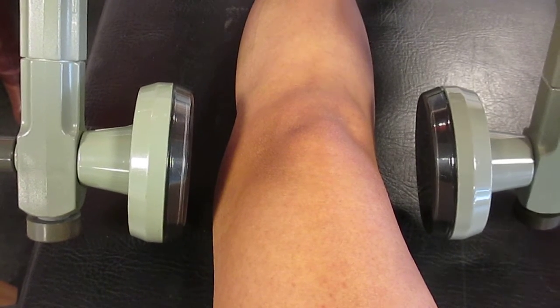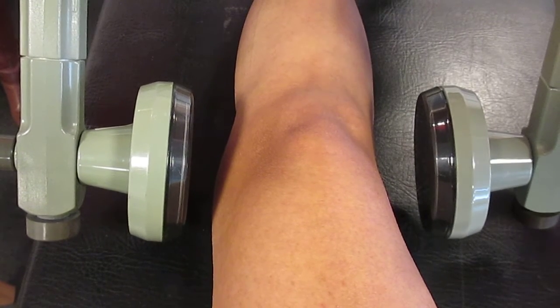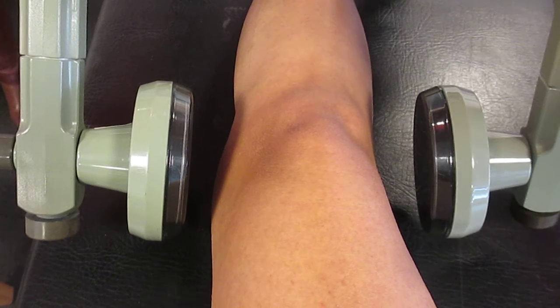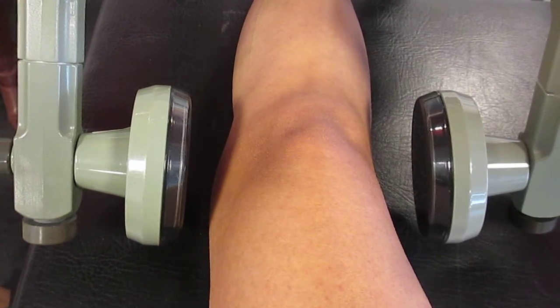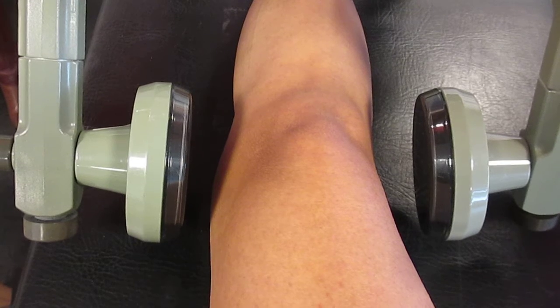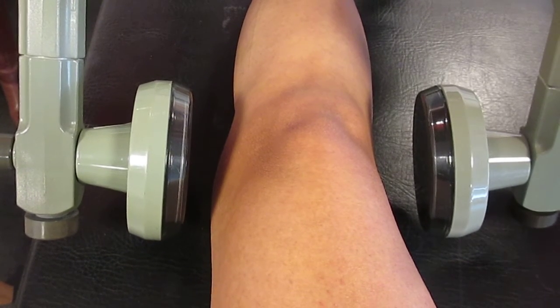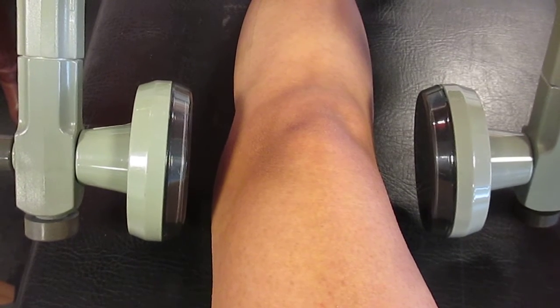If this was a chronic condition, perhaps something like osteoarthritis of the knee joint, and you wanted the thermal effects as well, then you would set the machine on a continuous setting and set the peak power to anything between 5 to 11 watts, informing the patient that they should feel a gentle warmth during the treatment, but not significant heating or any discomfort as a result of that.